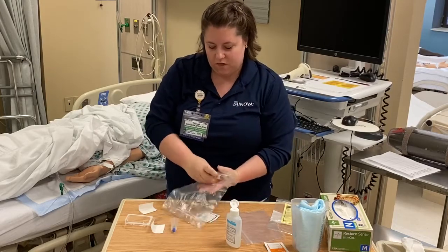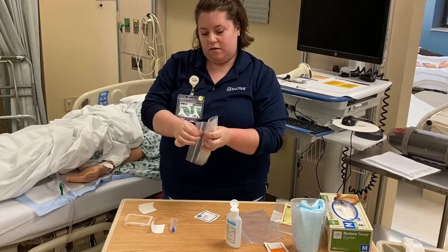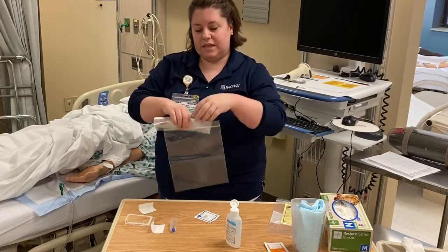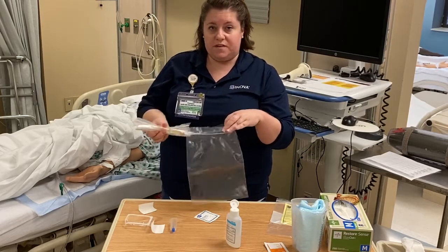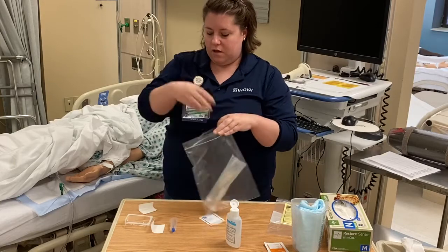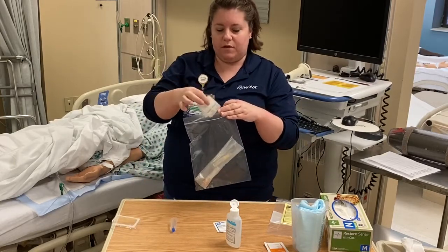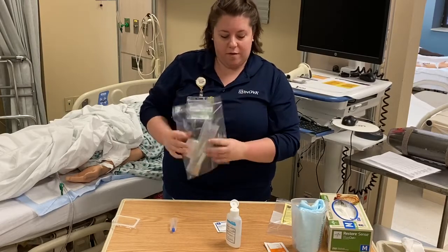And then I'm gonna roll this up. I like to make sure the air is out. This bag is going to go inside of my second bag, because if the tubes were to open in the tube system, we won't want the urine everywhere. And then I'll put the little labels that came with my big labels in the second bag. This is now ready to go to the lab.